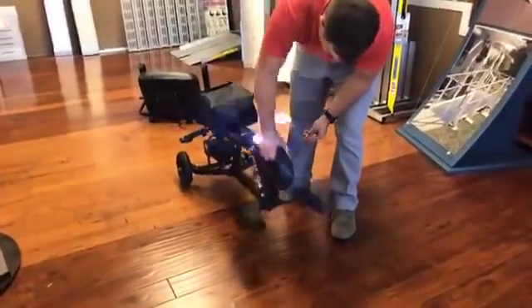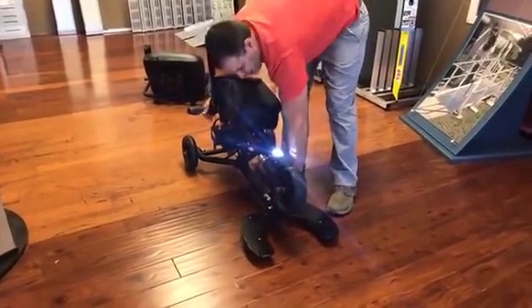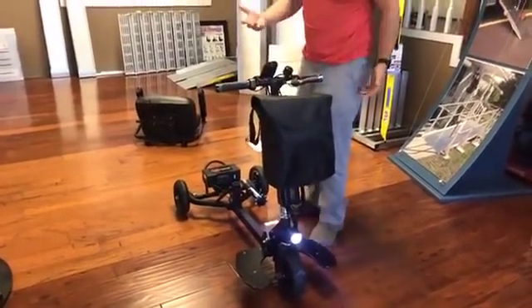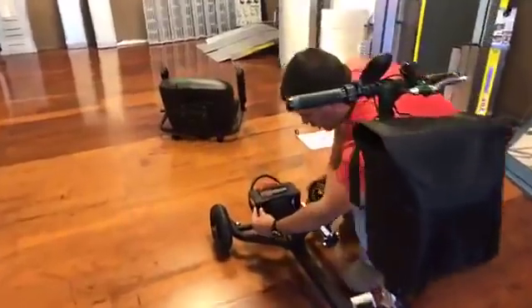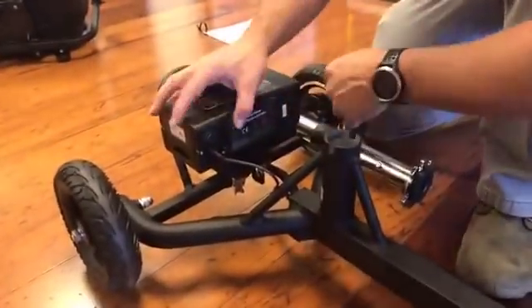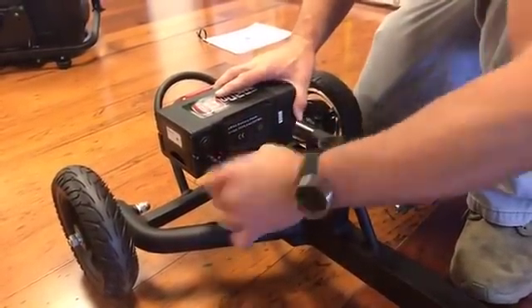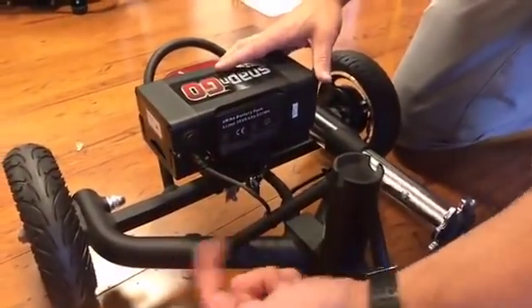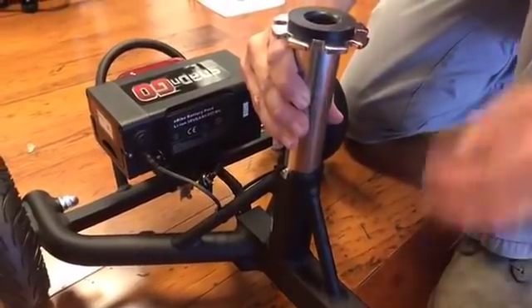But that's a nice little feature that you can flip it up and raise that up to drag it along, say if you're in an airport or something of that nature, or hotel. Snaps right back in place. Here's your battery. You can actually turn everything on and off with this switch here. This key is actually to lock this battery where somebody couldn't take it off or it wouldn't just fall off. So that's what that key is for, to lock that in. Literally just plugs in right here. Take this, drop this, line this up right there.